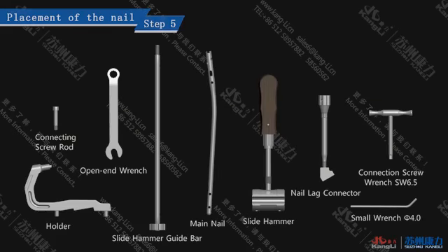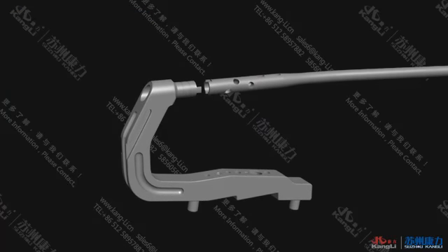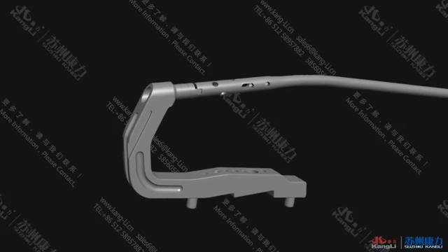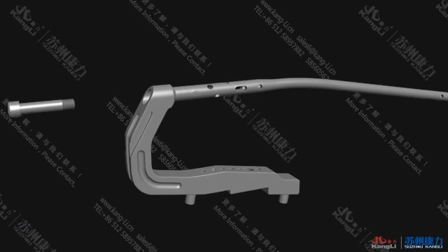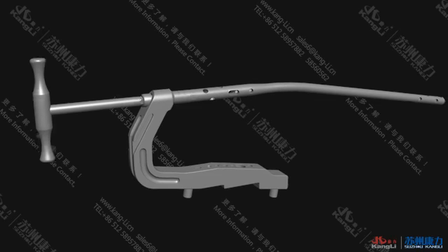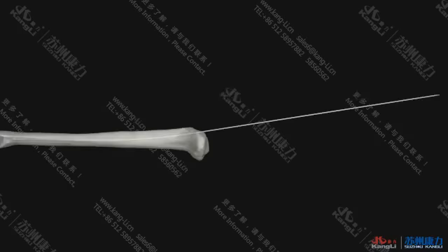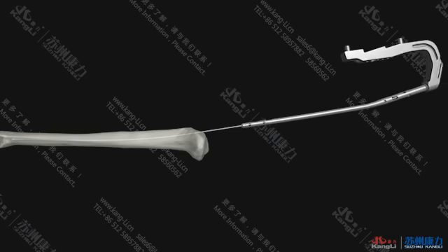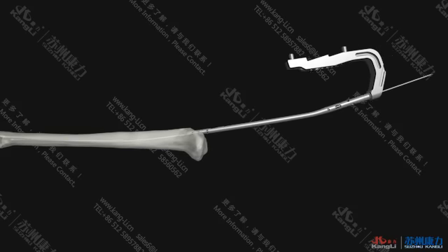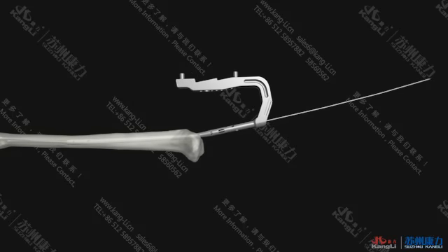Step 5. Placement of the nail. Fix the prepared nails of KTO tibial intramedullary nailing system onto the holder with the connecting screw rod and tighten it with the connection screw wrench. Insert the ball guide pin and rotate slightly for the entrance of the nail. After the entrance, keep the direction and directly insert it.